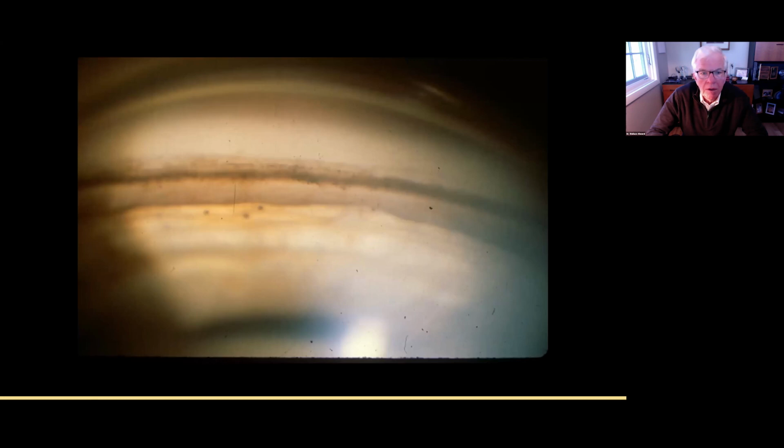Just another angle recession, since there were so many questions about it. You can see the wide ciliary body face that's light in color. And these are actually little dried up balls of old blood. That's also helpful in making that diagnosis. And this is one where you can actually see a radial tear.